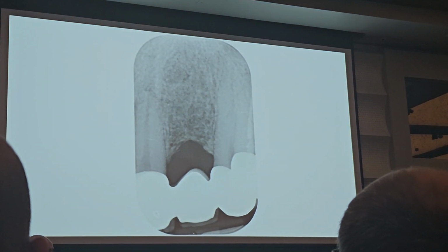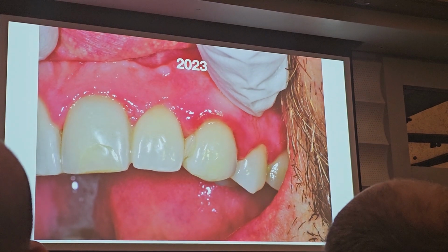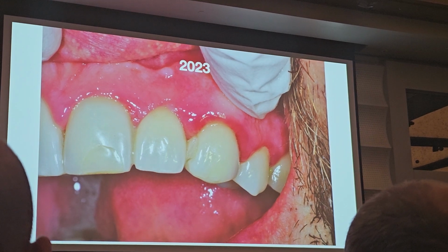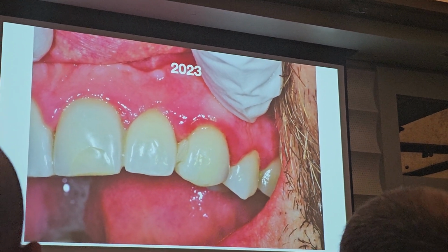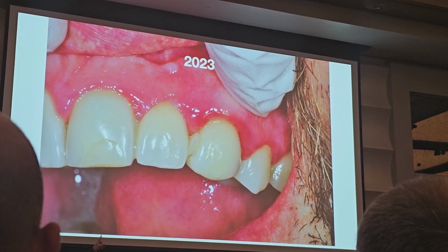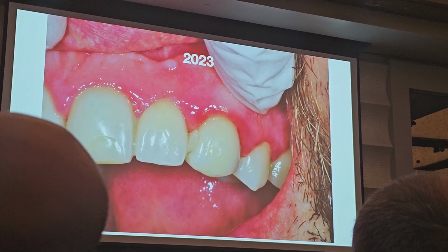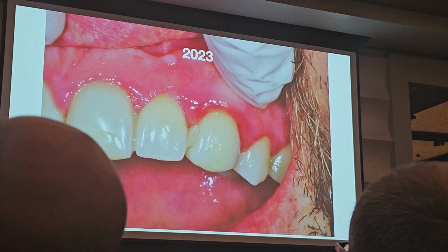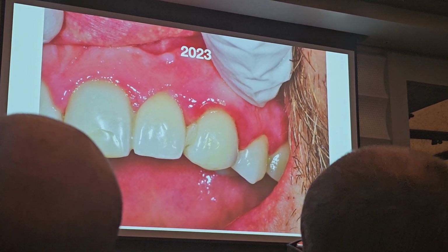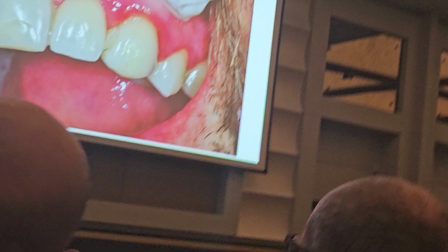I did a zirconia bridge. Everything was perfect. The patient was super happy. But then, in 2023, first he came with the fracture of the ceramic there. Okay, and 1 week later, he came with the fracture of the connector. I will show you why this happens. Every time the zirconia bridge breaks, there is one single reason.